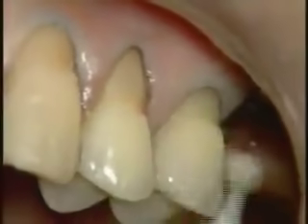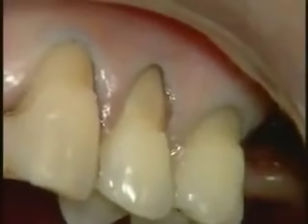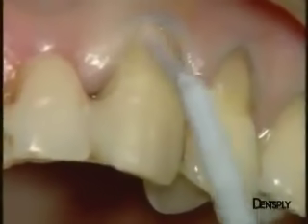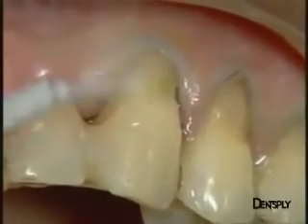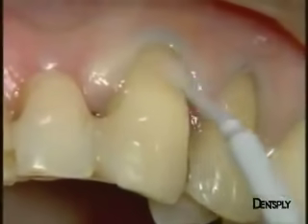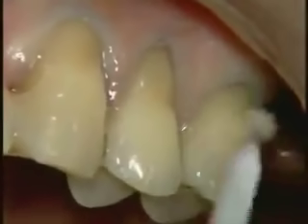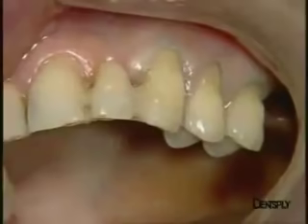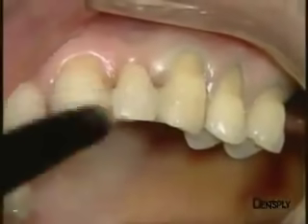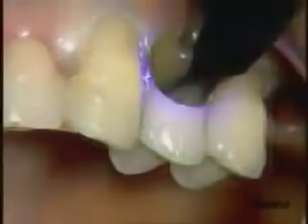The adhesive system used here, Xeno III, is a single-step self-etching material. This feature is particularly beneficial in this type of situation where we have dentine that is not very permeable and rather sclerotic. It also ensures that the adhesive system penetrates well into the enamel to seal it properly. The adhesive is applied very carefully, and we reinforce its penetration by rubbing the surfaces gently with the applicator tips provided by the manufacturer, and we do not rinse. We evaporate the solvent immediately by a gentle air blow, thus avoiding any contamination of the dental surfaces. The adhesive is carefully polymerized tooth by tooth before dispensing the filling material.